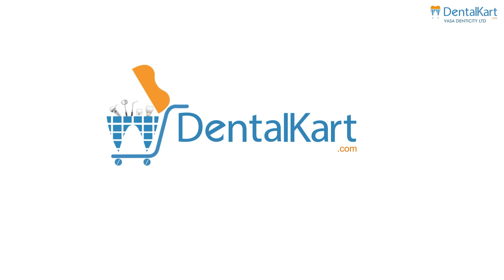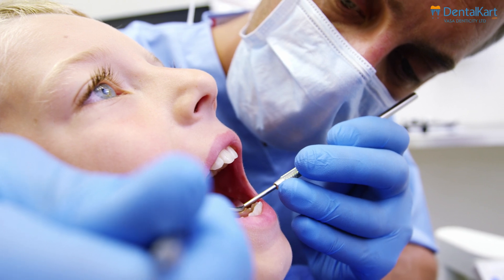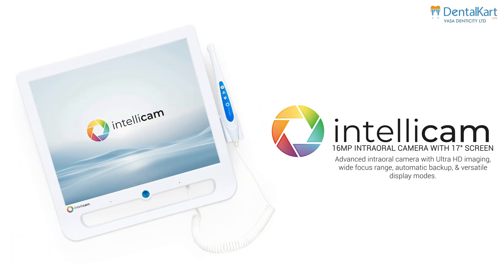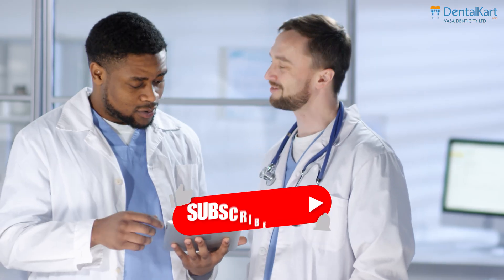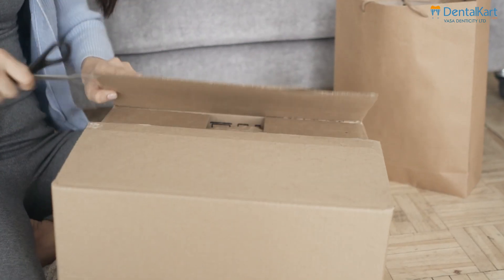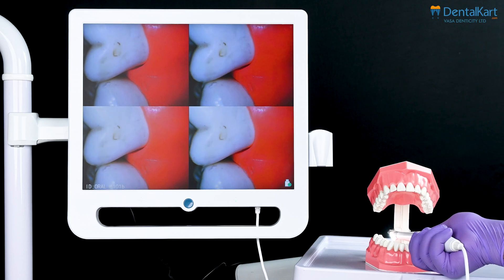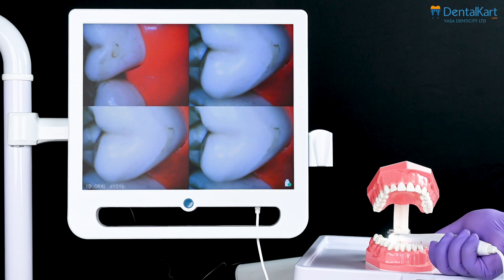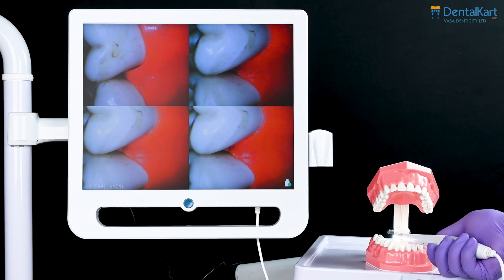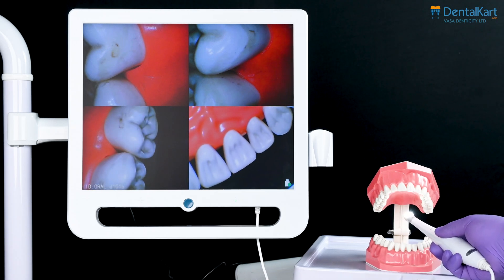Hey everyone, welcome back to our YouTube channel. Today I can hardly contain my excitement as we delve into a device set to redefine how we approach oral health — the IntelliCom 16 intraoral camera. Whether you're a longtime viewer or a newcomer, subscribing guarantees you'll always be in the loop. Now let's uncover the mysteries of patients' smiles with the IntelliCom 16, designed to capture crystal clear, high definition images of the oral cavity, providing a precise visual representation to help diagnose and treat issues accurately and confidently.